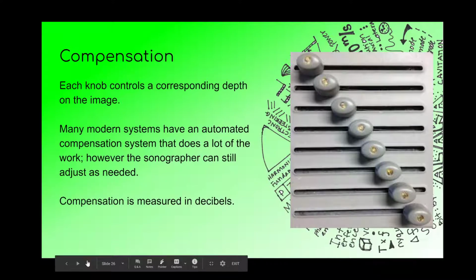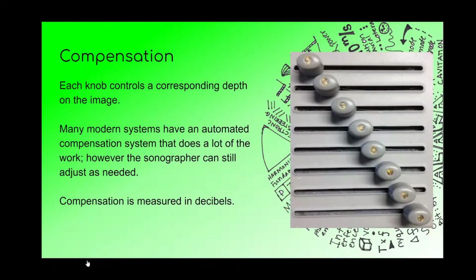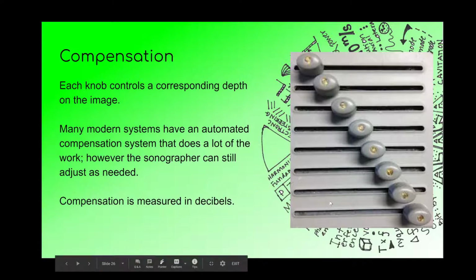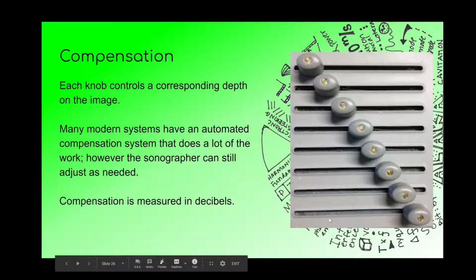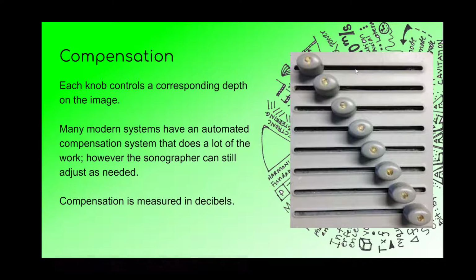Again, this is another area that you've probably manipulated in your pictures, not knowing quite what you were doing with it. You've been compensating for the attenuation that occurs in your image. We usually have these little sliders somewhere on the board of our ultrasound machine, and what these sliders do is compensate for the attenuation that's occurring, or the lack of attenuation even. The top sliders are for the near field, where the bottom sliders are more for the far field of the image. As you move the sliders to the left, the area typically gets darker. If you move them to the right, the area typically gets brighter.